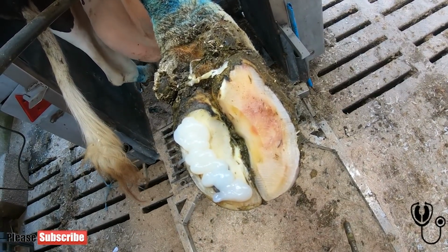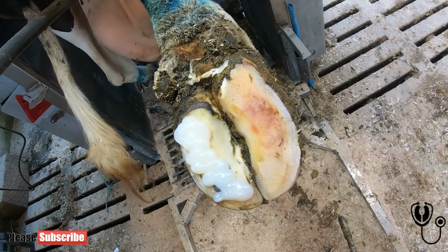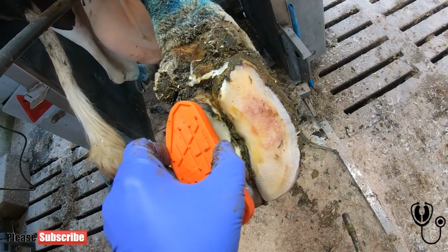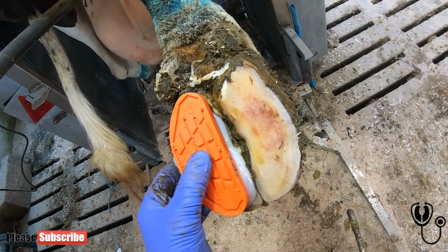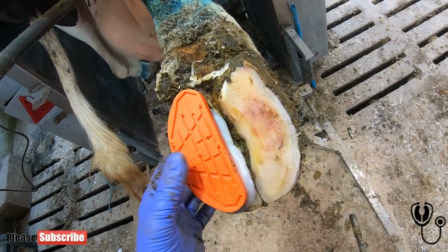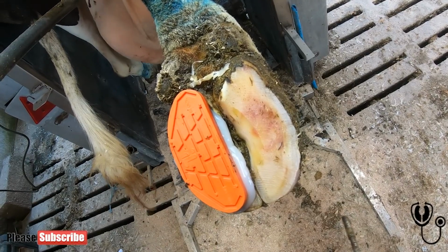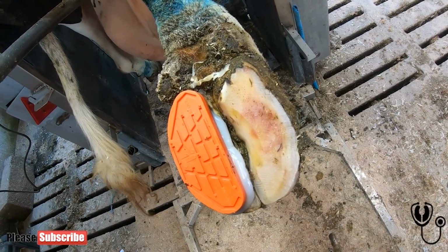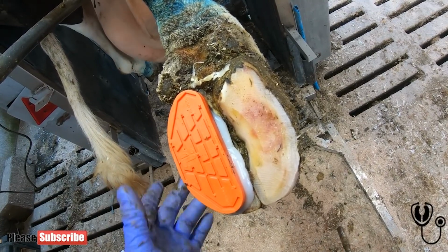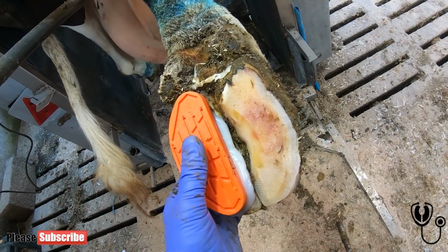Put the glue on like that, just wait sort of 5 or 10 seconds so that the air starts to harden it. Put it on, squidgy it back and forward. The squidginess gets it into all the little gaps. And then it's important not to really push too hard yet. Wait another 10 or 15 seconds, and then push harder.